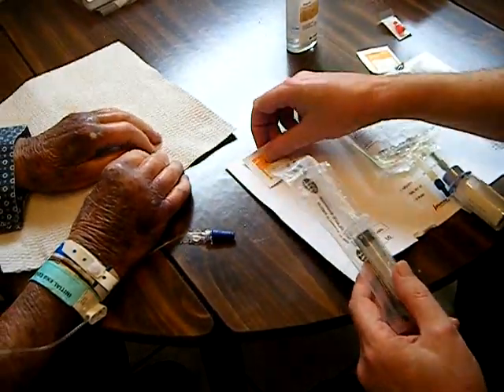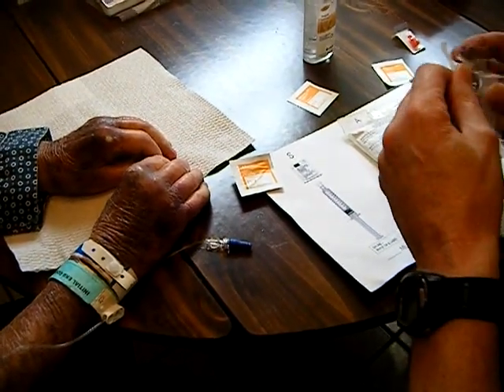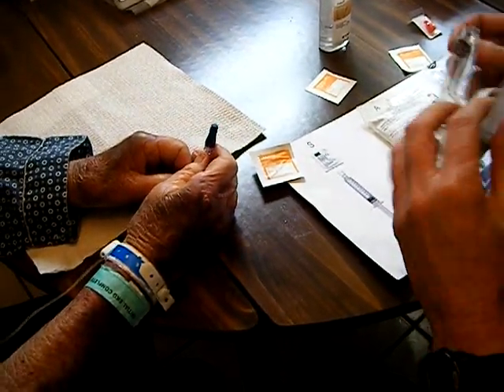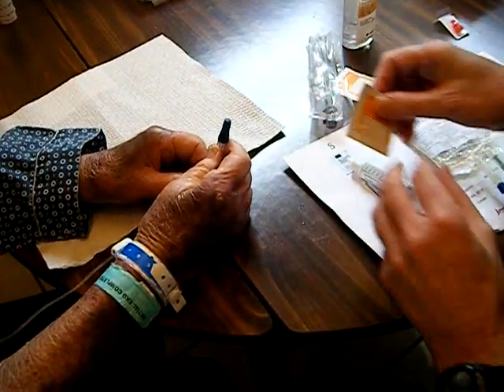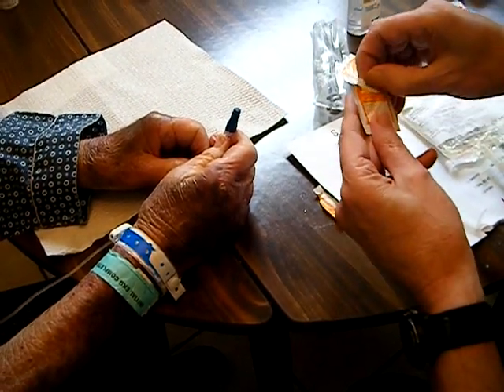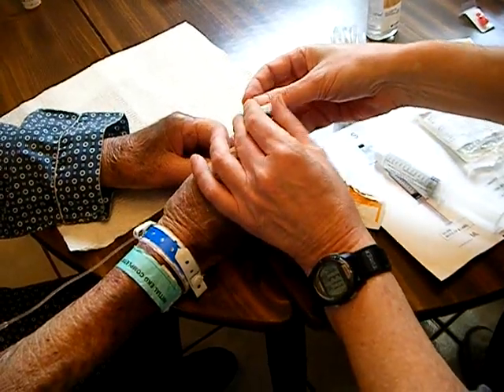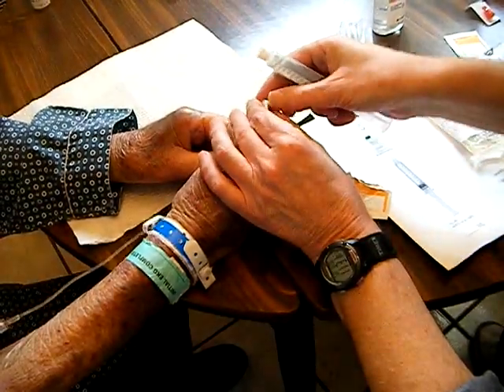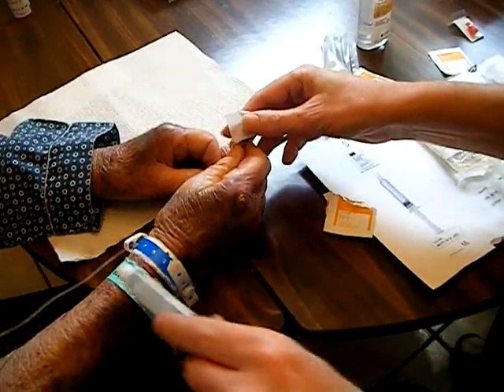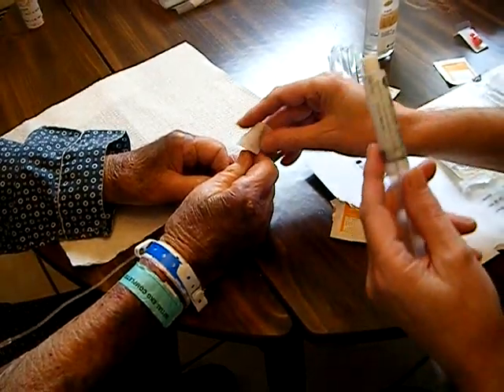Here's our first step and here's our alcohol swab. The alcohol swabs are important because we're administrating antibiotics which are meant to fight infections. So it would be quite a folly on our part to defeat the purpose by contaminating his apparatus while performing. Now I'm unzipping an alcohol prep, and this is to sterilize the point of where the first syringe will — the first syringe which is filled with sterile water — will flush out the vein and residue from the previous IV.